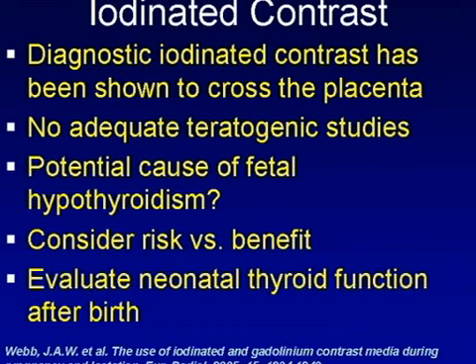Now, the other issue regarding CT use in pregnancy that we need to address is the safety of iodinated contrast. Diagnostic iodinated contrast does, in small amounts, cross the placenta, and there really haven't been any adequate teratogenic studies to look at what the effect is on the fetus exposed in utero.